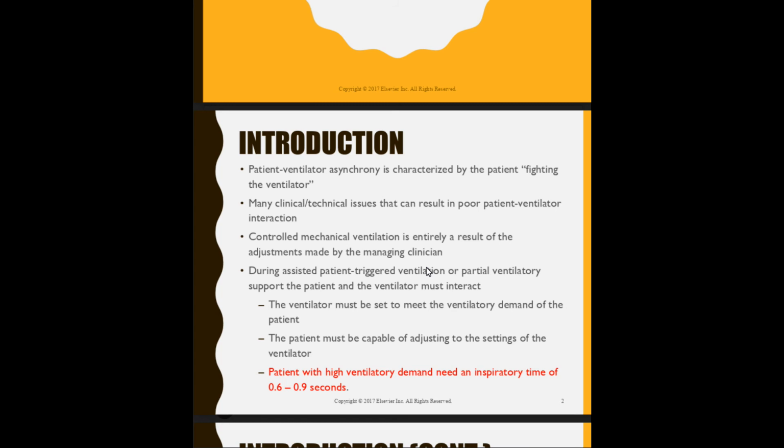So based on that, sometimes our calculations are off, or sometimes there might be a physiological, or there could be some type of biological reason why they are not syncing with the ventilator. Okay, so that's where you also have to look at your vent check sheet. You want to make sure if they're trending correctly or they're not trending correctly.